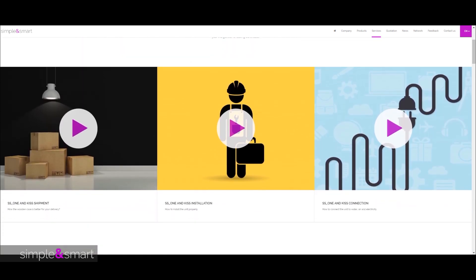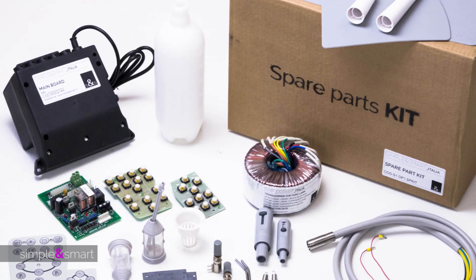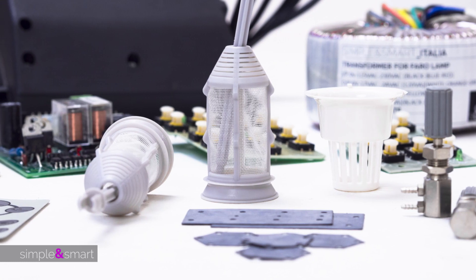We have internal technicians that can modify the unit following your indications. Choose the spare parts kit you like to keep in your practice — you can avoid lost time waiting for spare parts to arrive.